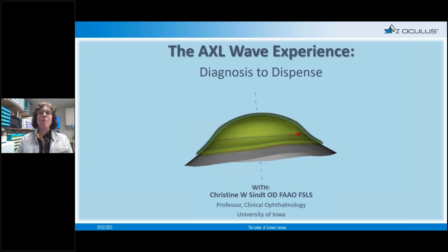That's fantastic. So I would like to talk about that whole diagnosis to dispense. So my practice is primarily sick and diseased corneas. And a lot of patients are sent to me for the diagnosis of what is going on with their eyes. So the AXL wave, the Pentacam is probably the most important piece of equipment in my practice as far as seeing the patient, diagnosing the patient, but also in my general clinic flow and patient flow overall. Next slide.